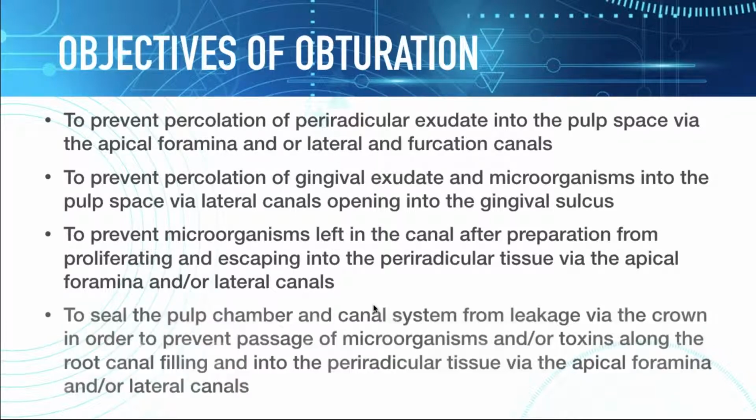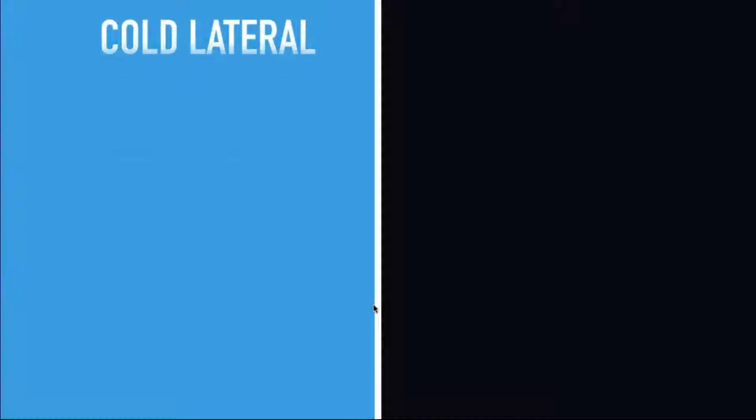So it's up to us with our obturation systems to entomb them within the root canal system and prevent them from flaring up, regrowing and repopulating the root canal space. Now, even the best of root canals and the most well obturated root canal systems, if they're exposed to salivary contamination by either a poorly timed or poorly placed restoration, that's how good root canals fail, from coronal leakage, and that's what we want to prevent. And those are the objectives of obturation.